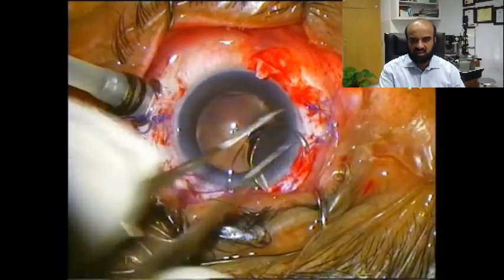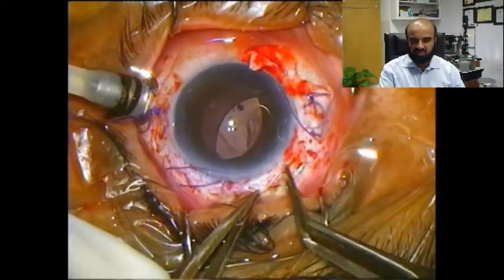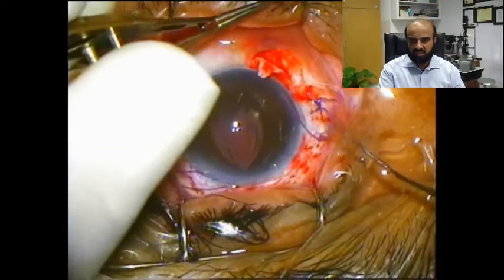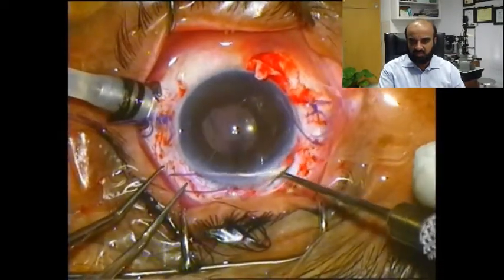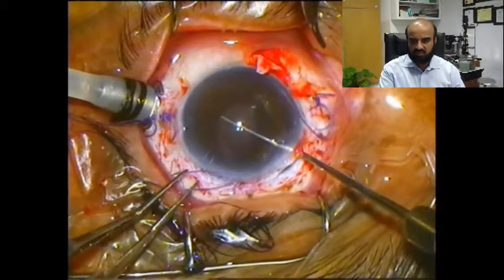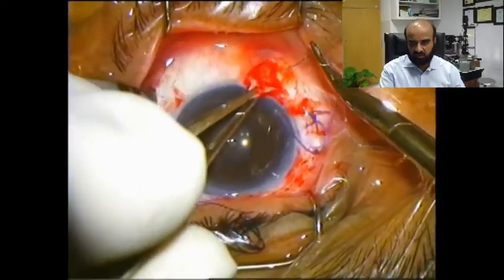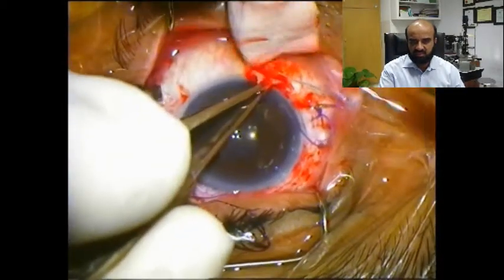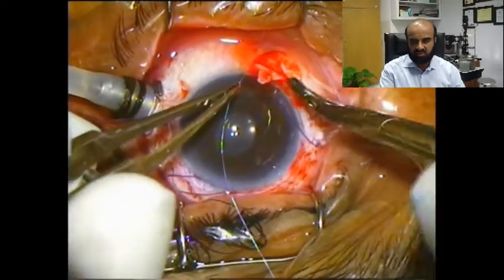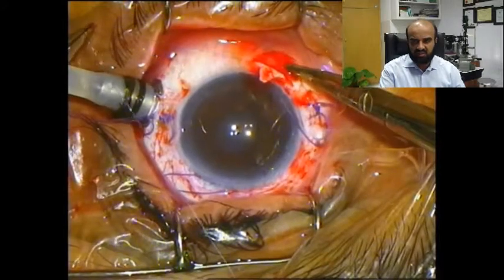The knot is being secured at the point of maximum convexity on the haptic of the IOL. The trailing haptic is placed first behind the iris and is dialed into position by applying gentle traction on the fixation suture, while the superior haptic is placed on the remnants of the posterior capsule superotemporally with the help of a dialer. Once the position and centration of the IOL is assured, the fixation suture knot is tied beneath the partial-thickness scleral flap by recurving the needle and taking a partial-thickness bite. The suture is tied to itself and a secure 3-1-1 knot is applied and the ends are trimmed short.